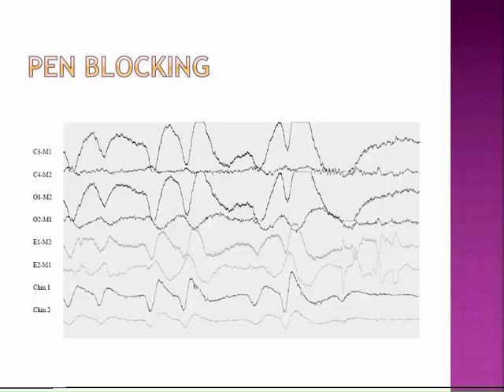However, when you see pen blocking in your EEG channels or your EOG channels, that's usually because of sweat. When sweat gets so bad, it starts to cause pen blocking. So instead of playing around with the amplitude of those channels, you would want to fix what's causing the pen blocking, which would be to cool the patient off. When you see pen blocking in the respiratory channels, that's an instance of needing to go in and play around with the height of the channels.